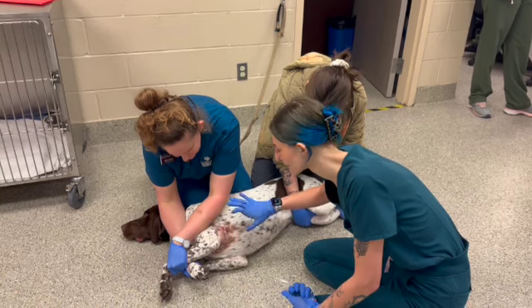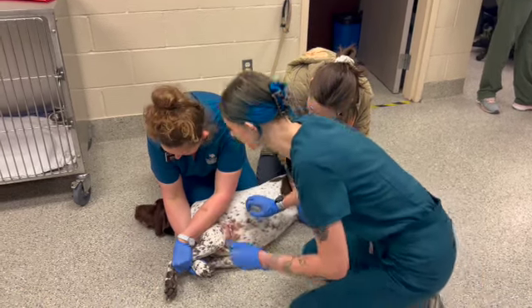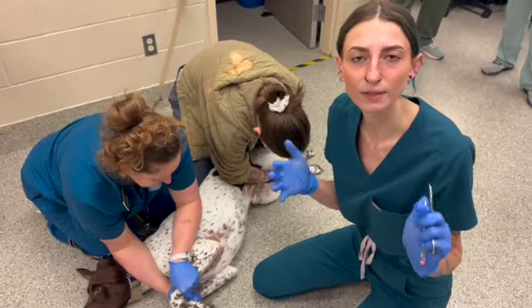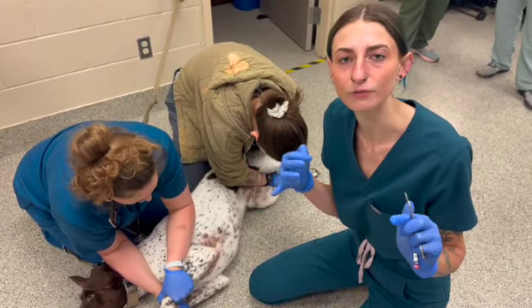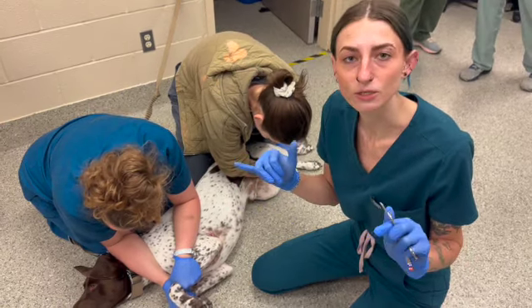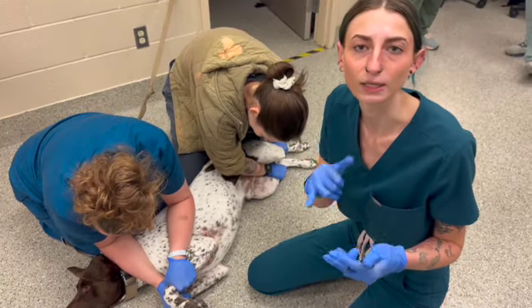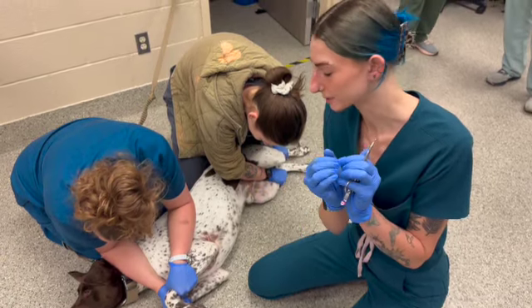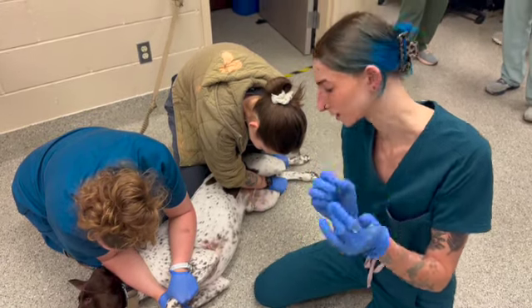Remove these sutures from Blaze today. And in order to determine whether or not the sutures are going to be removed, it's typically going to be about 7 to 14 days after the surgery or after the wound care has been performed. And you want to make sure that there's no redness or swelling or discharge coming from the suture site. And you want to make sure that the skin has come together nice and snug.